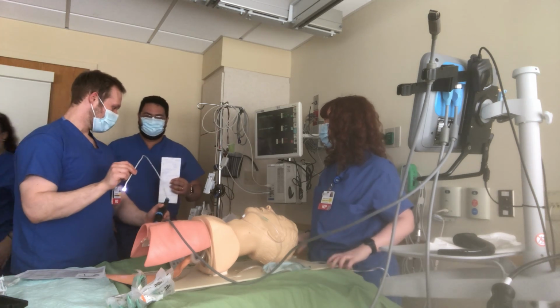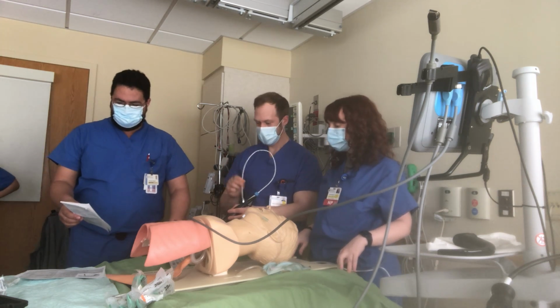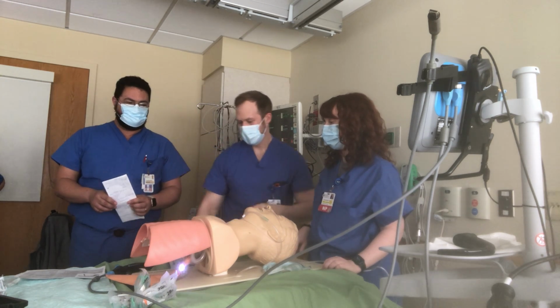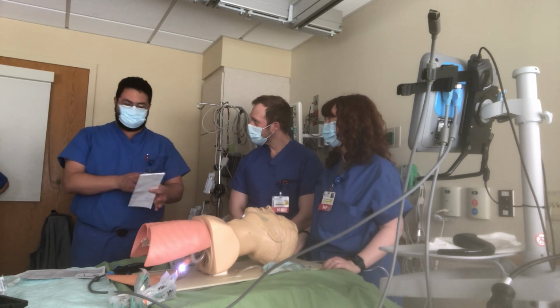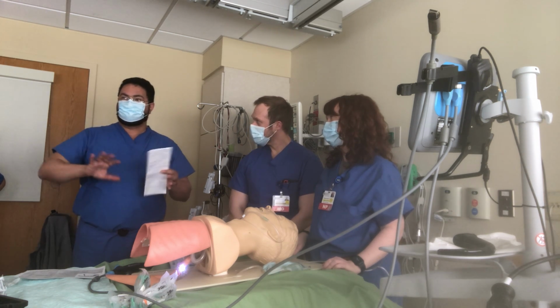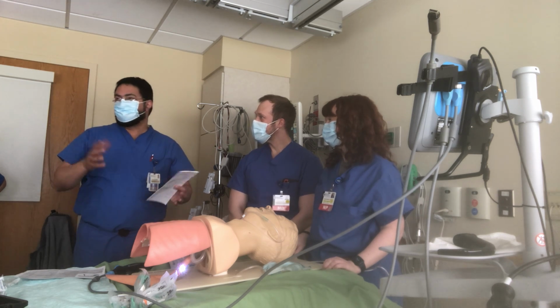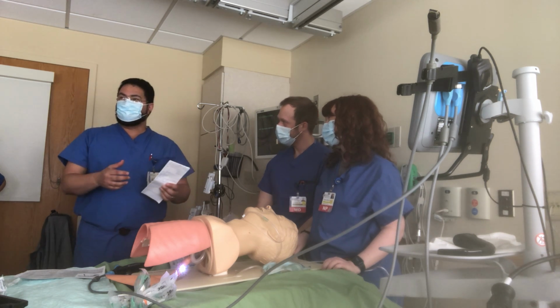Anesthesia, isn't it? So you want me to put it here? What we're gonna do is, hold on. Leave the fiber optic for a second, because nobody's gonna tolerate the fiber optic just by doing this. What we're saying here is that we can't ventilate the patient, but his oxygenation is fine. It's 92%, but there's no way we're gonna ventilate this guy. So we decided that we burn 2 bridges. We're gonna go to awake fiber optic intubation. So we're not gonna give him anything other than numbing his airway, or maybe at the end we'll give him something just before. But we have to start numbing the airway, and we have to take our time.